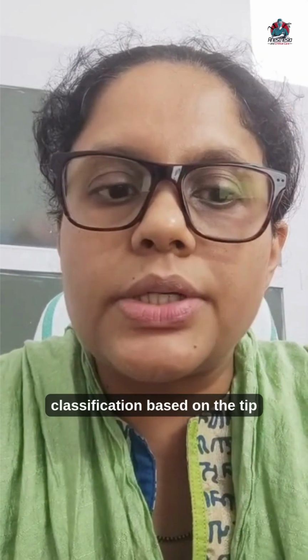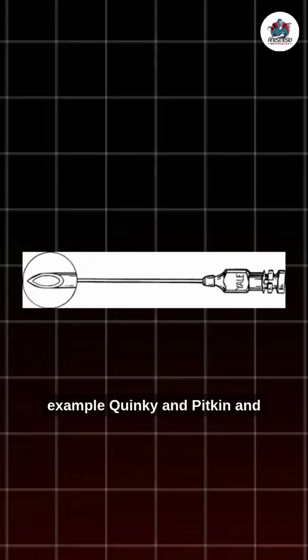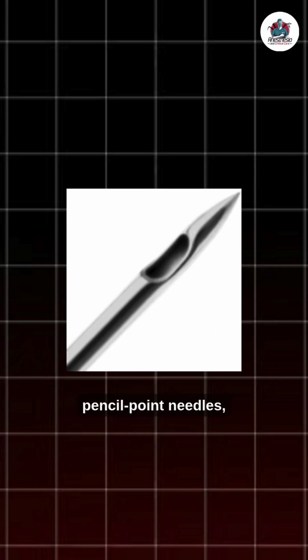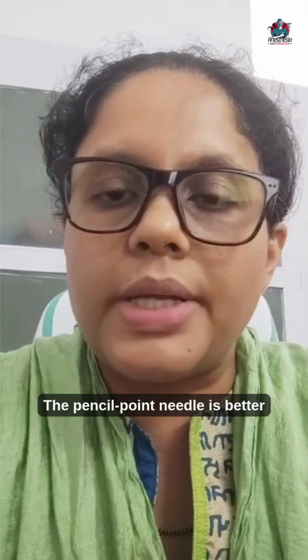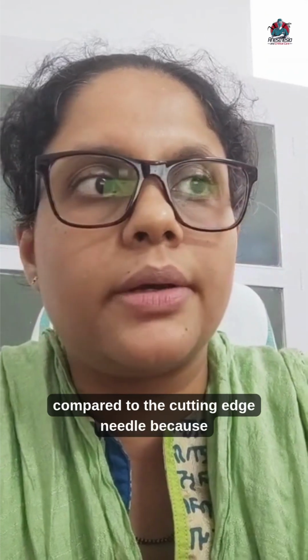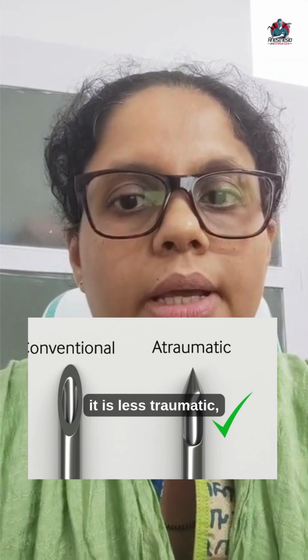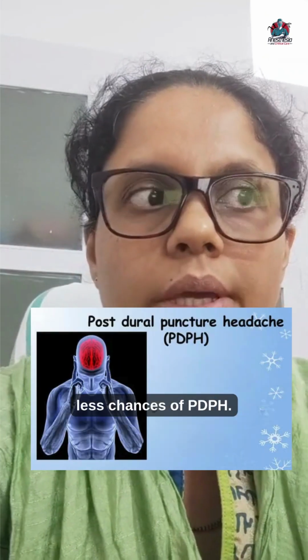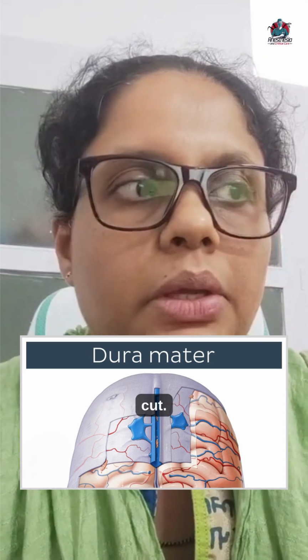Now, classification based on the tip design. It is classified into cutting needles, example Quincke and Pitkin, and pencil point needles, example Sprotte, Whittaker, and Green. The pencil point needle is better compared to the cutting edge needle because it is less traumatic, less chances of PDPH, and the dura is just separated and not cut.